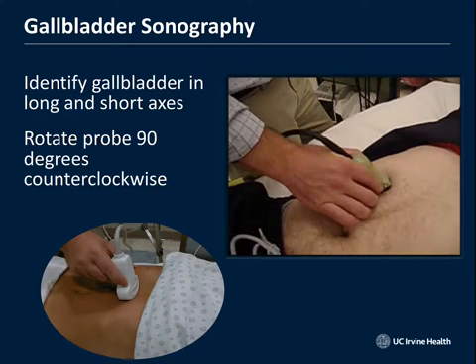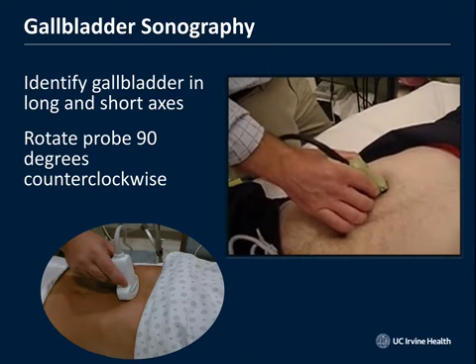Very good. Now, once you get the gallbladder in the long axis, then you're going to rotate 90 degrees into the short axis.